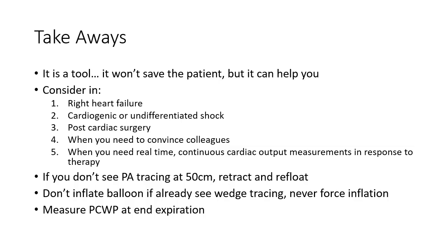Never force inflation. And also keep this in mind. If you inflate the balloon partially and you see a wedge tracing, you don't need to keep inflating the balloon. You've already wedged. So at that point, I would say let it deflate, come back out, inflate the balloon, and then you can re-advance as the balloon's inflated to wedge, because that's probably the safest thing to do, to not overinflate and cause further issues. Because remember, that catheter can sometimes migrate as it's just sitting in the patient with that balloon deflated, so be cautious of that if you're going to re-wedge a patient.